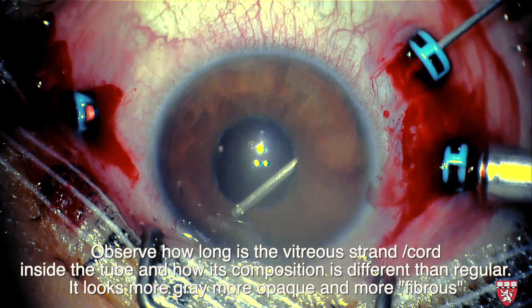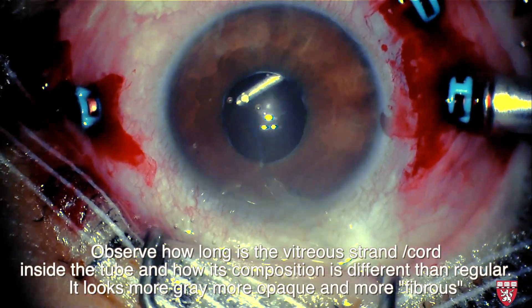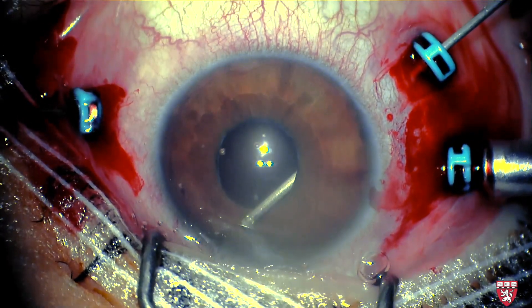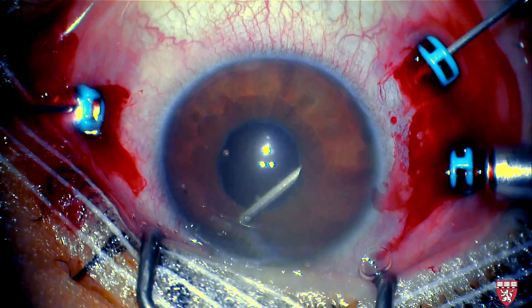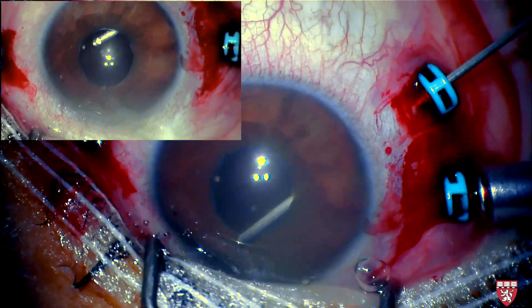Here the vitreous that is plugging the tube is being removed. Notice how long the vitreous strand inside the tube is and how its composition is different compared to normal vitreous. It is more gray, opaque, and fibrous than normal vitreous.